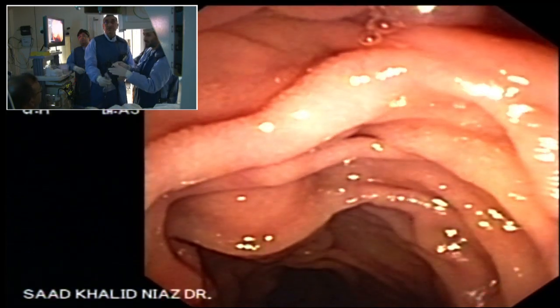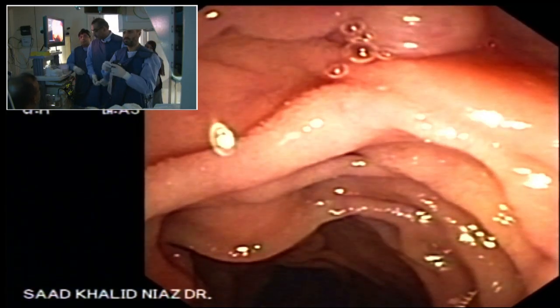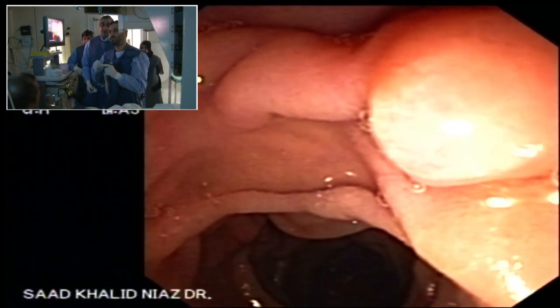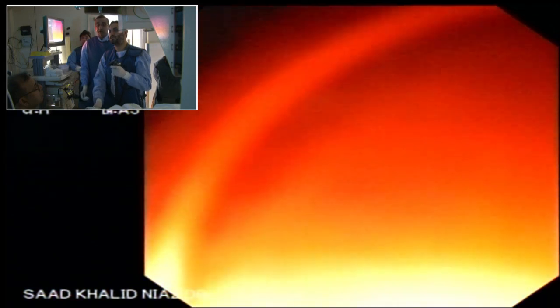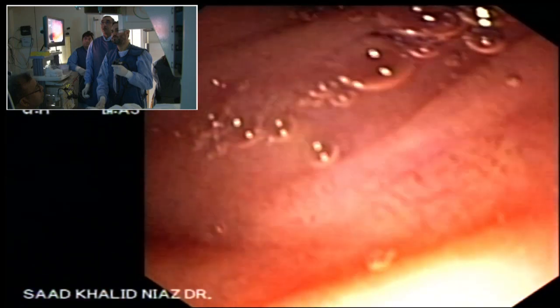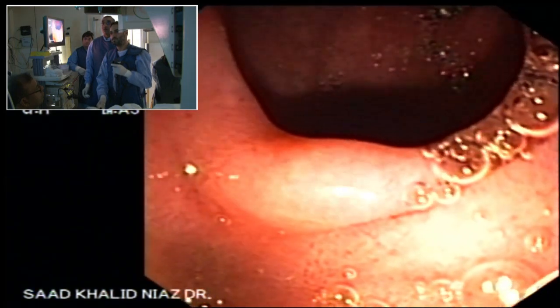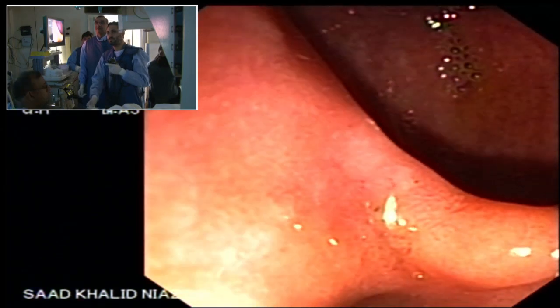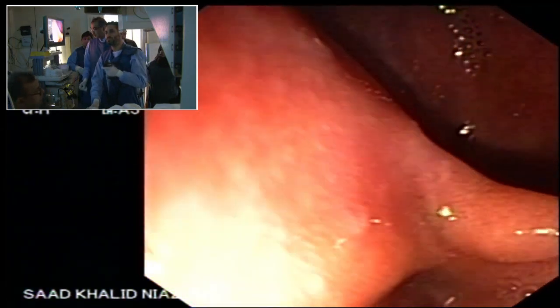Now, when you are at the duodenal apex, it's the same concept of right and lock. When you are going into the duodenum, you look for the duodenal lumen, and you have to bring the scope back through the pylorus, like it should be in the unlocked, neutral position. The lumen now, withdraw your scope, just at the right sunset, just like you had with the pylorus. So you cannot keep looking at the whole lumen and push. You have to make it like a sunset, the second part of the duodenum. Did you notice that? That's how the position was.